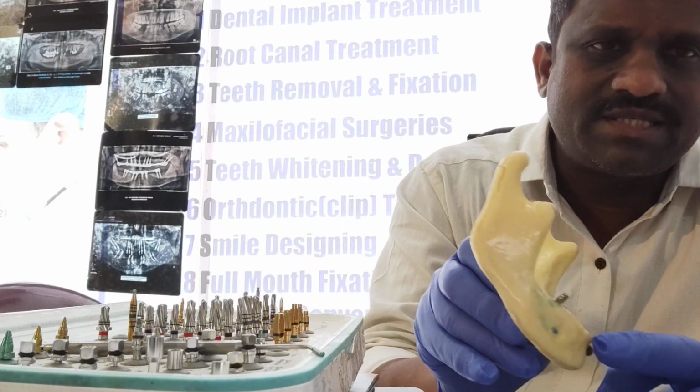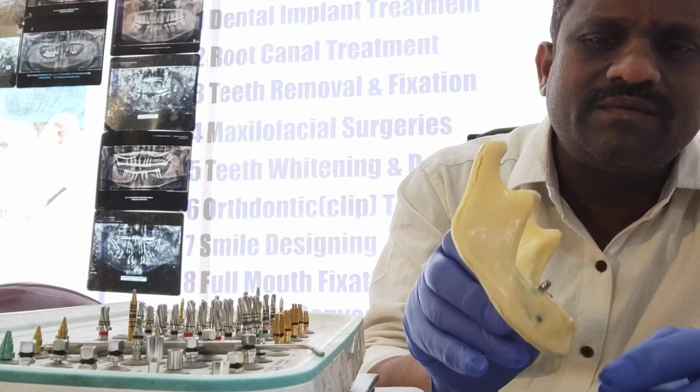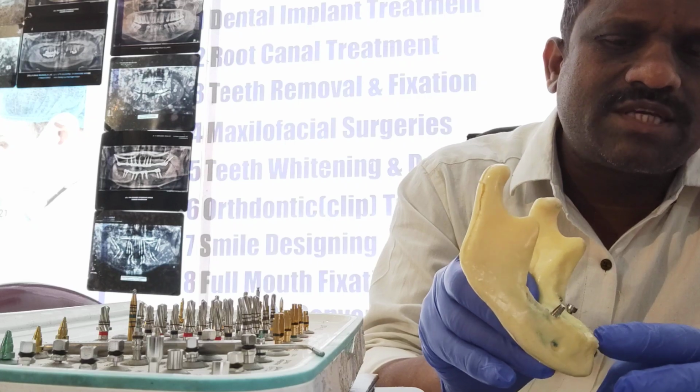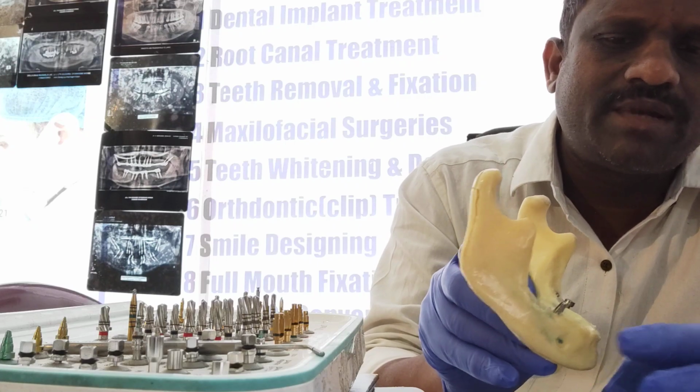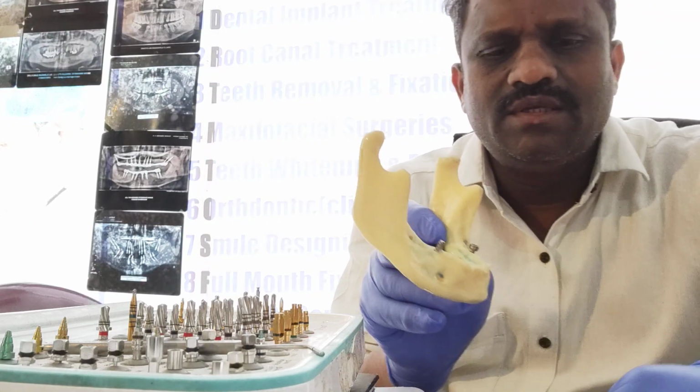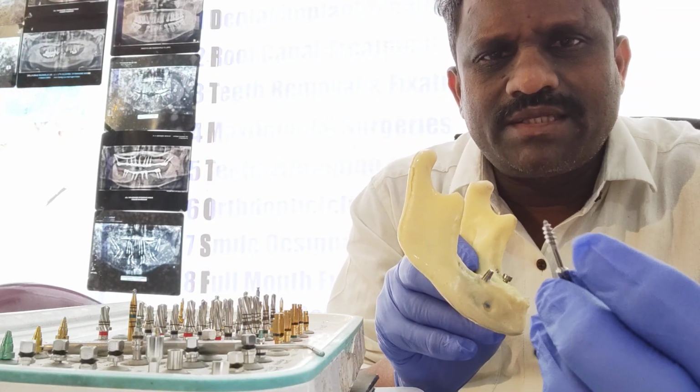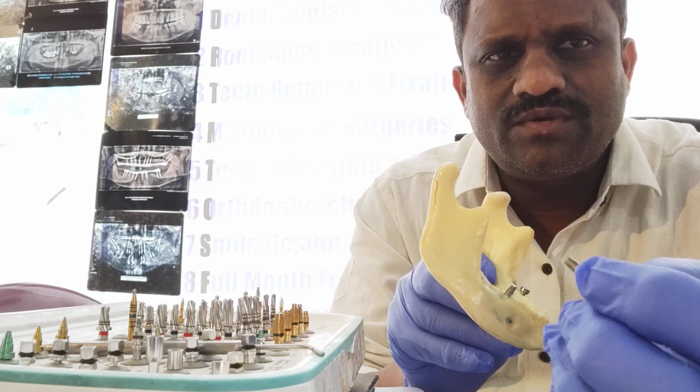So at another few places osteotomy has been done. I will not discuss the steps of osteotomy. I will discuss the placement of corticobasal implants in the lower anterior mandible. I have with me this BCS implant, that is bicortical screw.